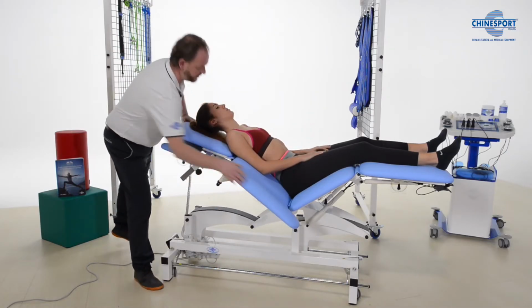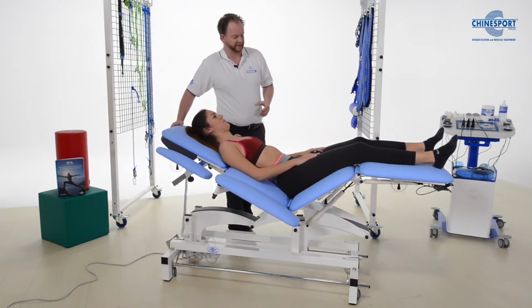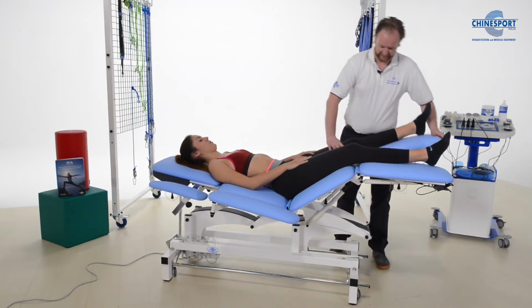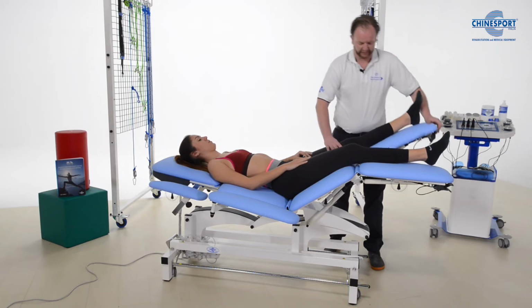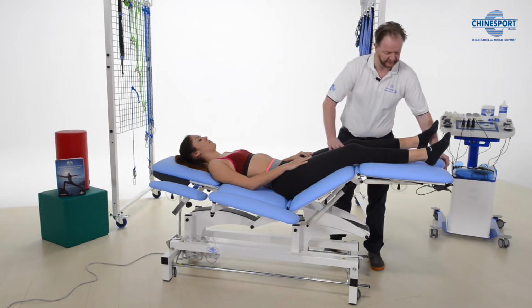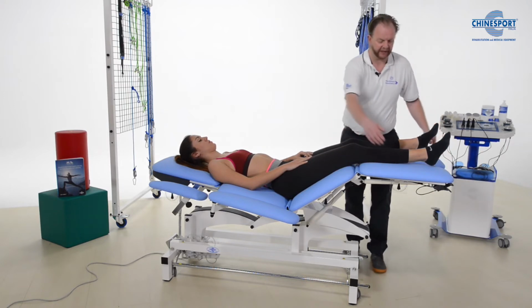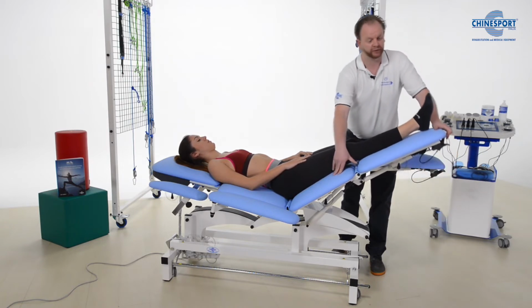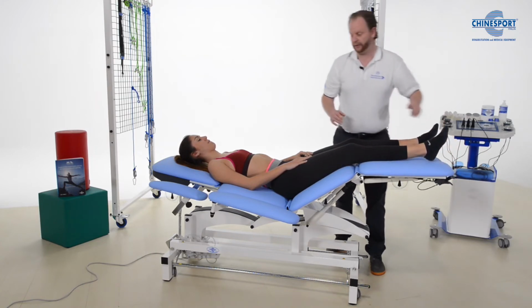Okay, the beautiful thing about the table is also that we can use it to do simple mobilizations. I'm just thinking of a knee pathology, for example, or even if we want to work with sciatic pain, we can work here. We can go up and down and just mobilize very easily, go into stretch and see when she's in pain. And on the table we have some goniometers here where we can see exactly how many degrees we are achieving when we are doing our mobilizations, so we know where we are with our treatment.